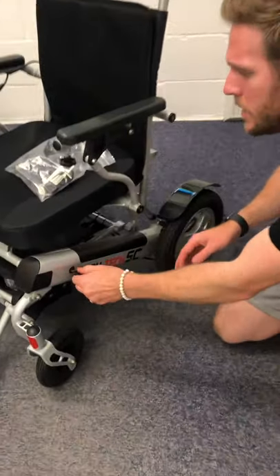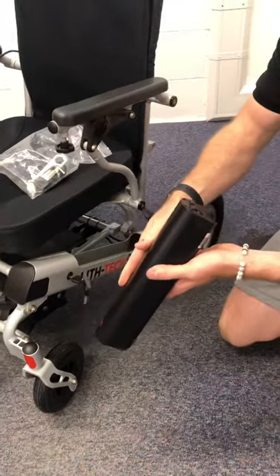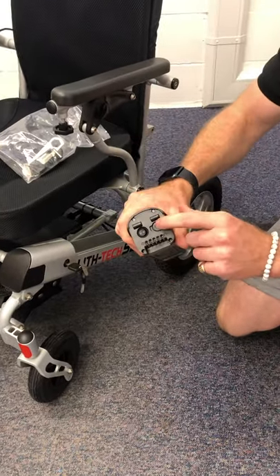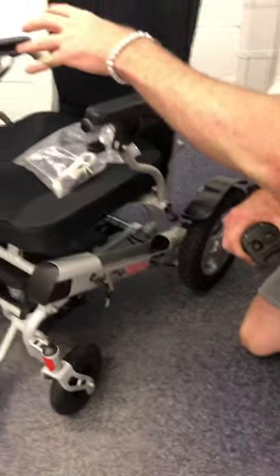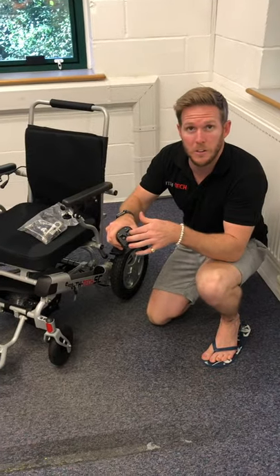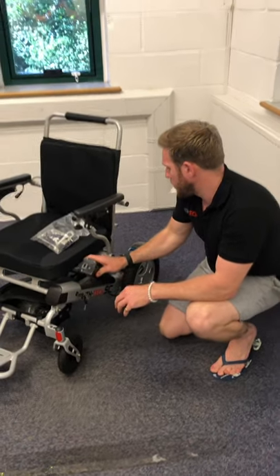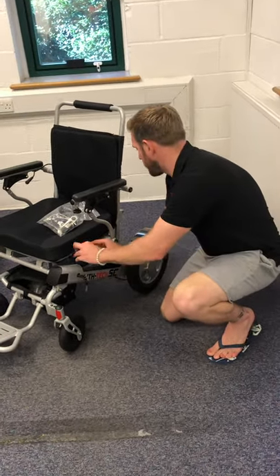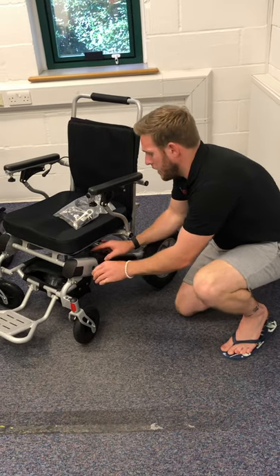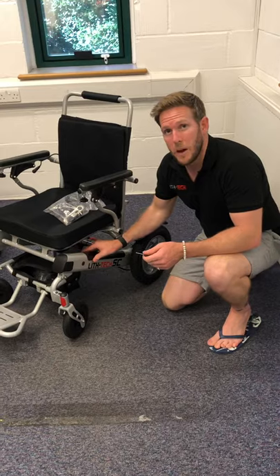You pop your key in here and your batteries simply slot out. On these batteries you can charge directly through the joystick if you want, or charge with our little charging adapter directly into the battery itself for off-chair charging. To pop the battery back in, you simply line it up in the back of the rack, turn the key, push down and pull. So no one can actually take these batteries at all now.